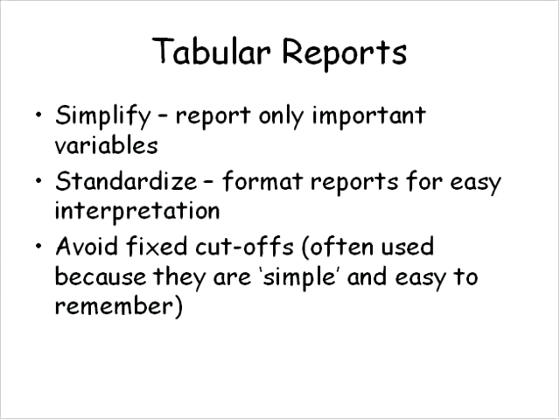There was a question from one of our participants. Diana had a question, and she says there has been some controversy in our department about what order to perform each of the maneuvers when doing a complete pulmonary function test. For years, the order that I did them was FVC, lung volume, then DLCO. Are there any ATS guidelines regarding the order? That's a very good question. It seems to be a question that comes up over and over again. And if you look carefully in the ATS/ERS published guidelines from 2005, you'll find that there really isn't any recommendation in terms of the order of performing the test.